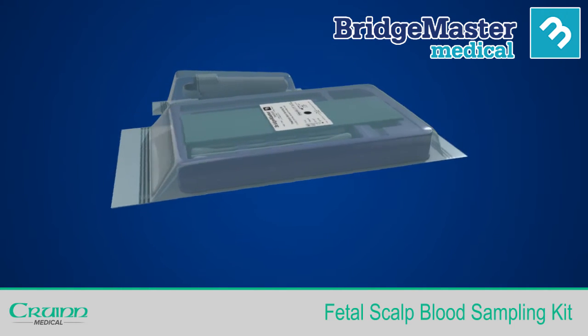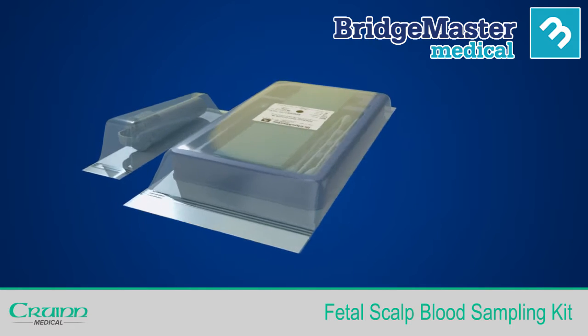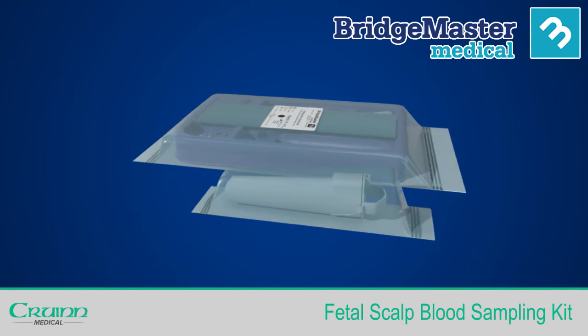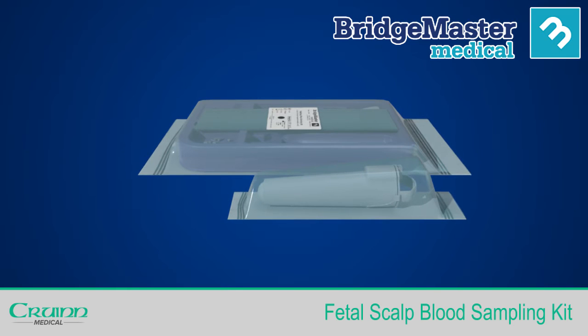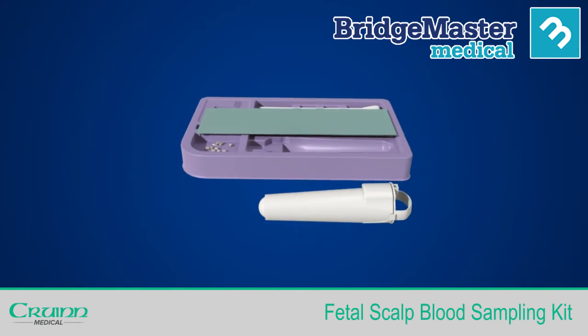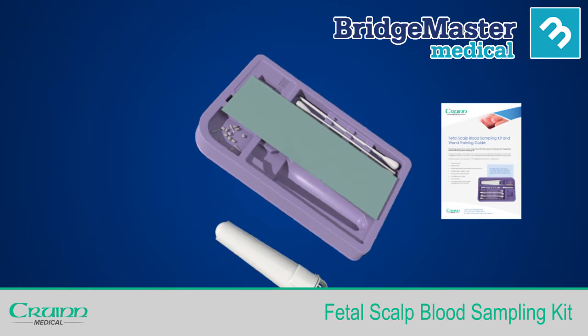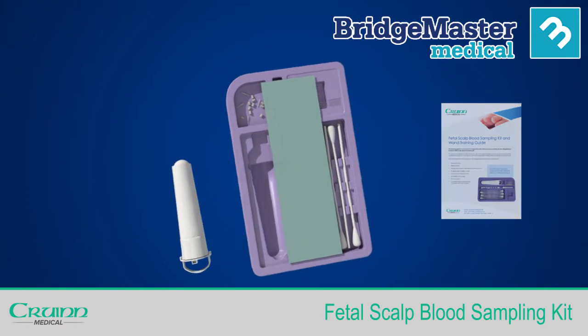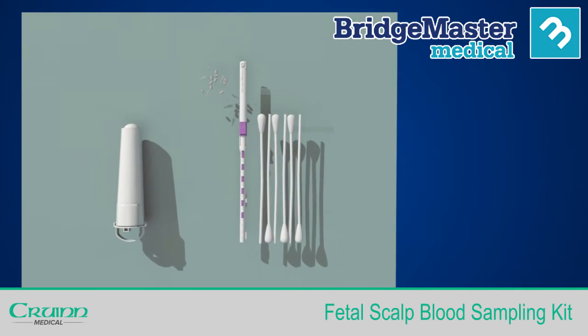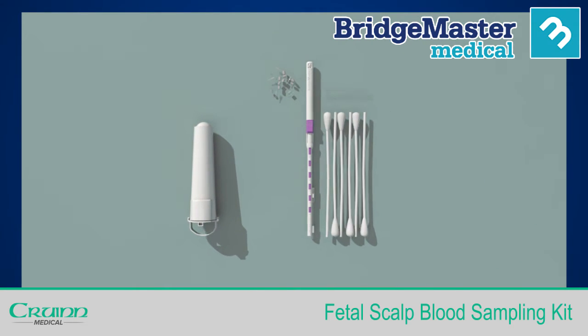The kit should reach you in a sterile condition, however it is always best to check for any damage before use. If damaged, discard. If not, then remove the packaging. Please consult the instructions for use leaflet included. Detailed instructions can also be found on our website if necessary. Remove the drape and place the kit and its contents where needed to provide a sterile working environment.